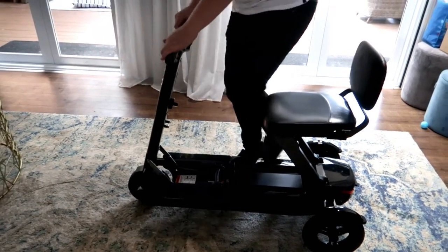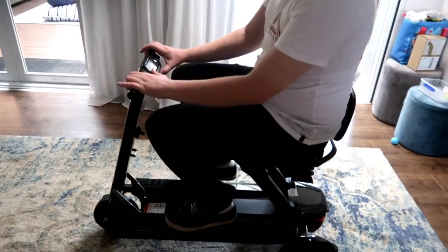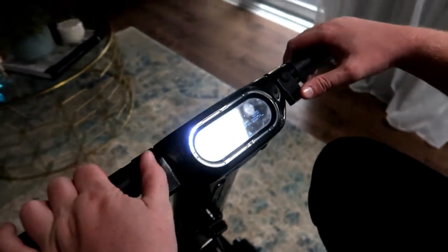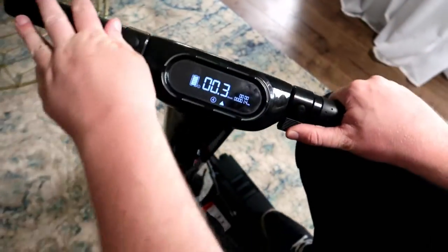We've got to lock it into ride mode — it was in free wheel mode. Turn it on and let's go.